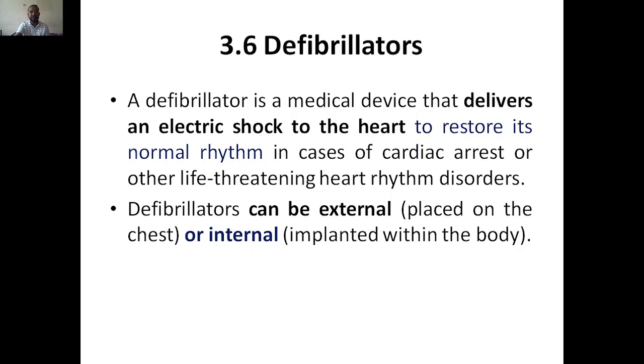In this topic we are going to study in detail what exactly defibrillators are, what materials are used, and what the purpose is. All those things we are going to study. So far we have discussed almost all topics under the heart. This is the last topic of this module.